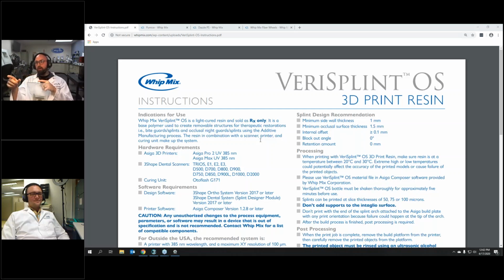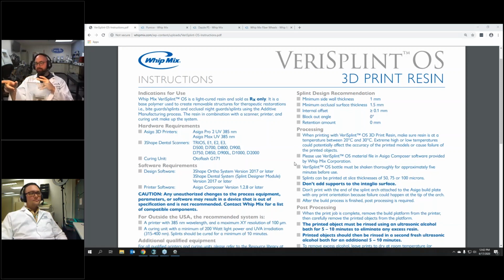Once again, we are going to start off with the IFU. So we can see Evan has it pulled up on the screen here.